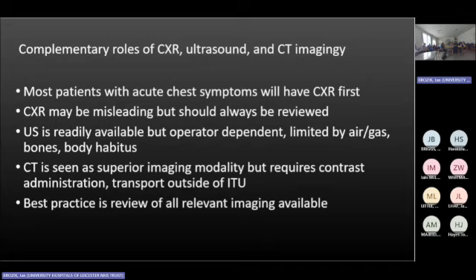Ultrasound. It used to be our imaging. Now you have ultrasound yourself, and ultrasound became the stethoscope of the 21st century, and you're now more confident scanning the lungs than most of the radiologists.